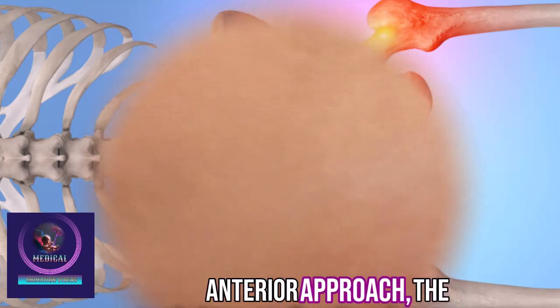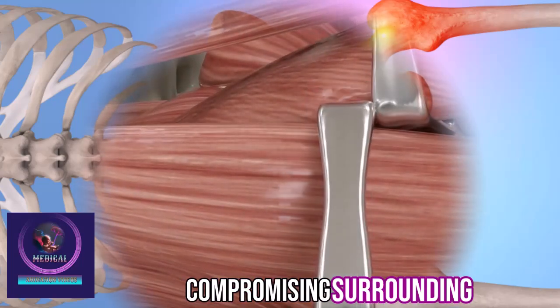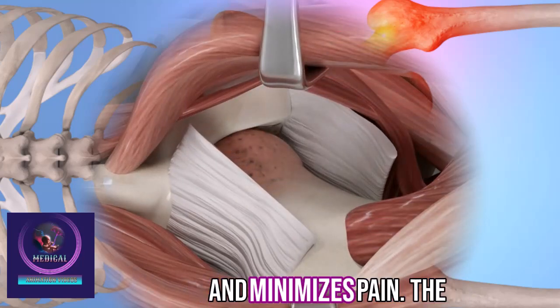Using a direct anterior approach, the surgeon accesses the hip joint without detaching or compromising surrounding muscles. Preserving these muscle attachments promotes faster recovery and minimizes pain.